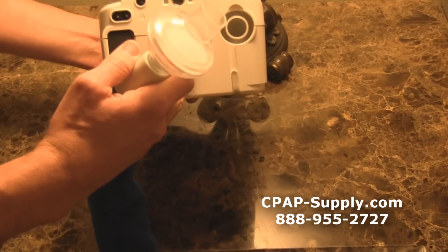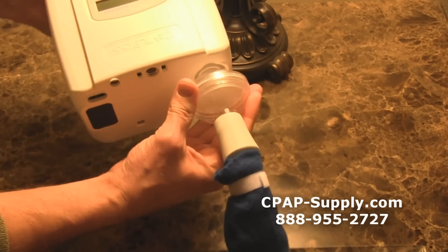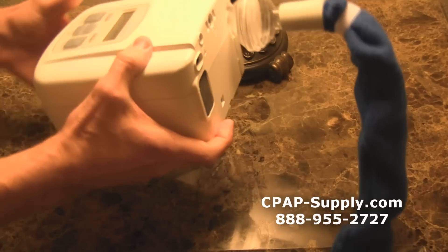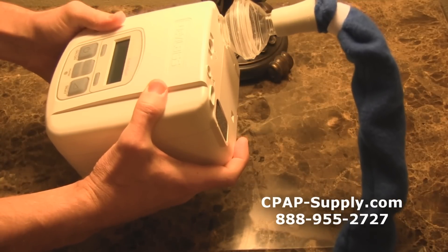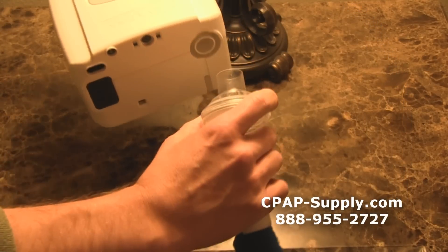It generally works just fine with exhalation pressure relief features like C-Flex, A-Flex, SmartFlex and EPR. The bacteria filter is great for allergy sufferers or anyone who is sensitive to dust. Adding this filter to your machine is also a good way to minimize noise in your CPAP tube.